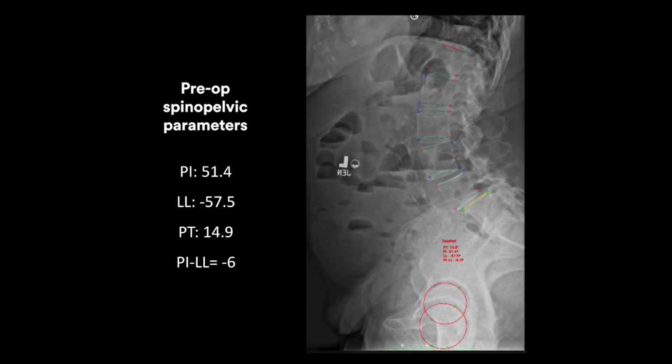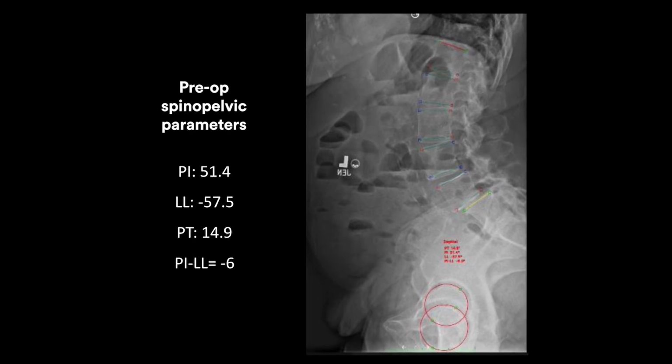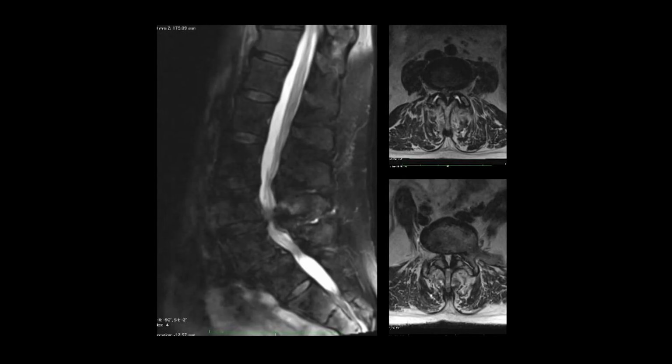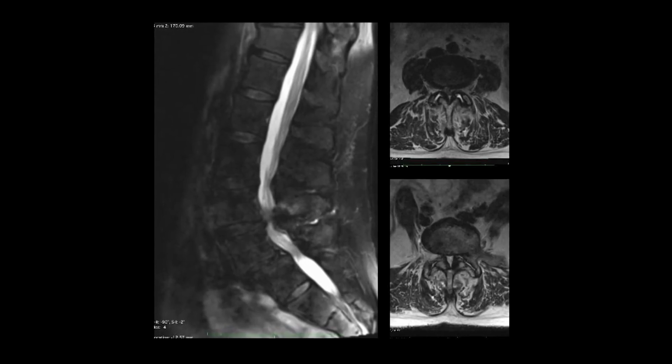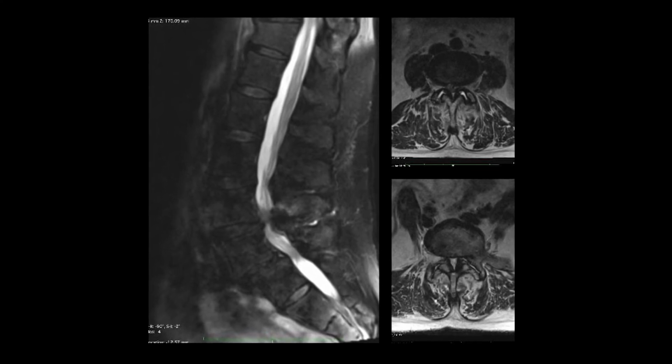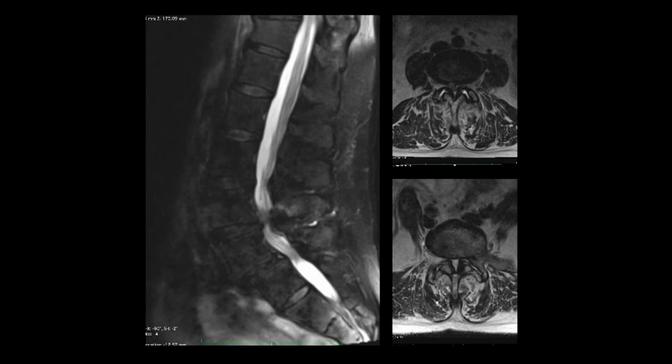So we did a right-sided ALIF at L5-S1, followed by XLIF at L4-5, followed then by single position bilateral pedicle screw fixation. And importantly, I relied only on indirect decompression here. So even with stenosis as severe as this that you see on this axial image, you have to be a true believer in indirect decompression to maximize the efficiency benefits of single position surgery. And I found that as long as I execute the case correctly, meaning restore height or correct the spondylolisthesis, indirect decompression just about always works.